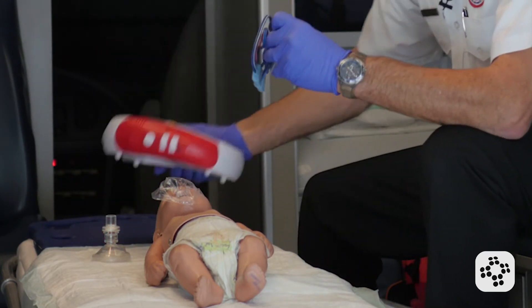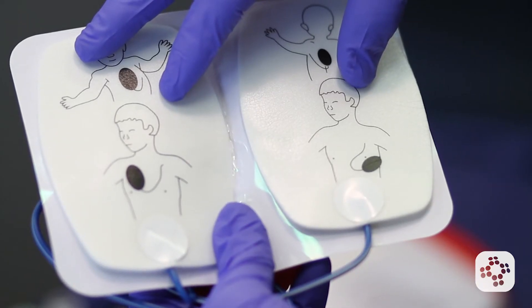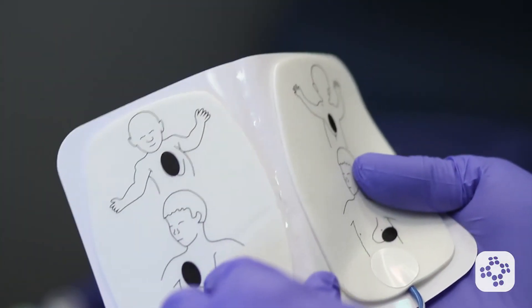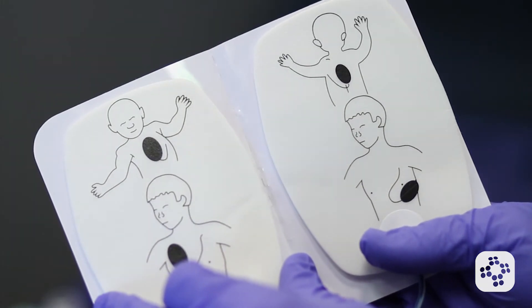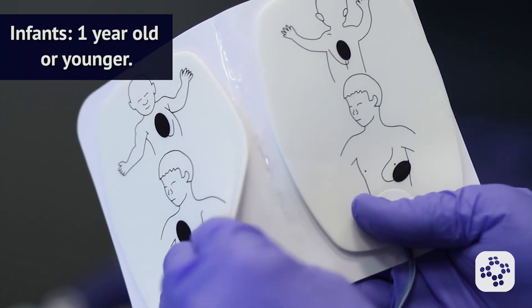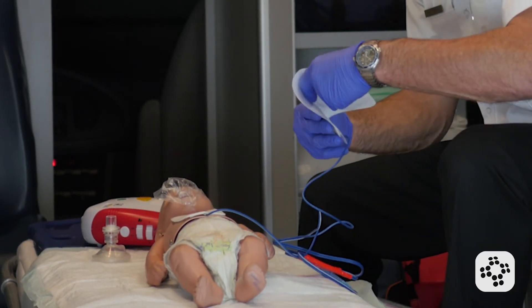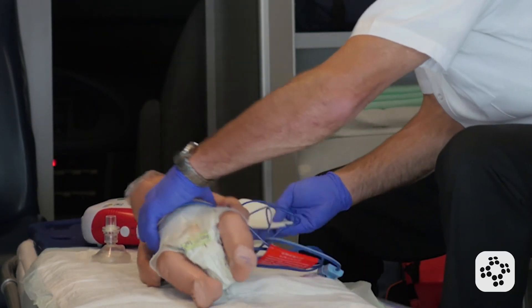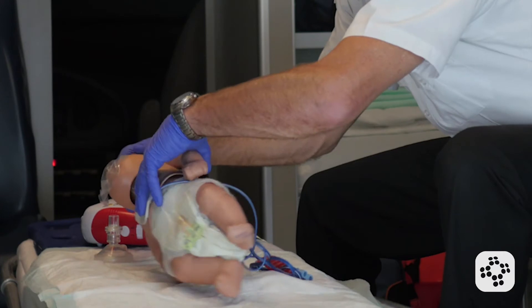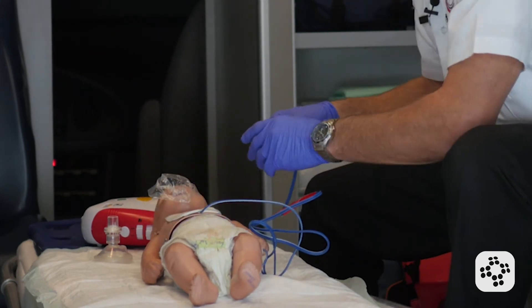The AED is prompting me to attach the electrodes, so I reach in and grab the infant size electrodes. If I didn't have infant size electrodes, I could use adult size electrodes. But if infant pads are available and it's an infant size patient — one year or younger — I'm going to use the infant pads. I attach one pad to the front of the chest and the second pad to the back of the baby. In a real baby, we'd roll them to their side, attach the pad, roll them back, and make sure both pads are firmly pressed onto the skin.